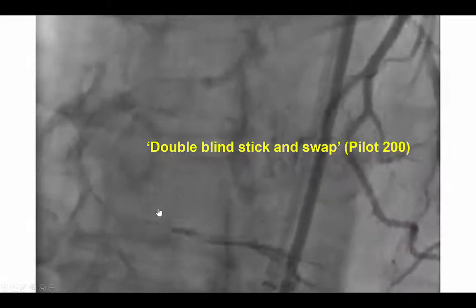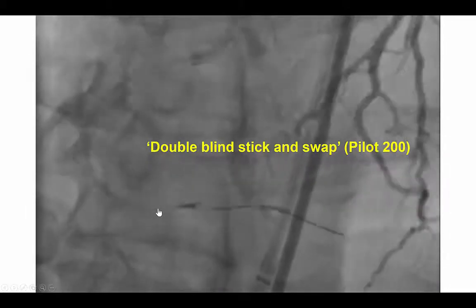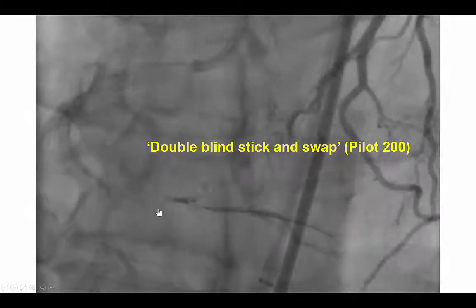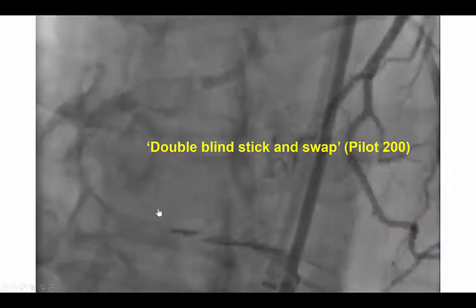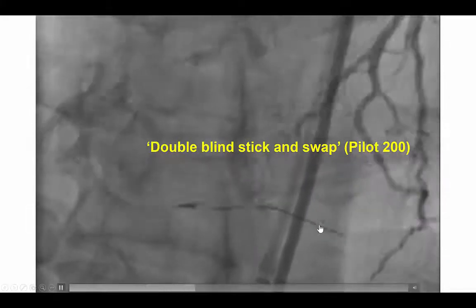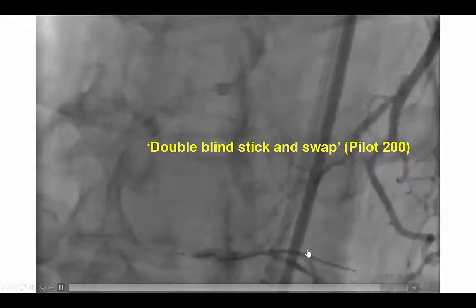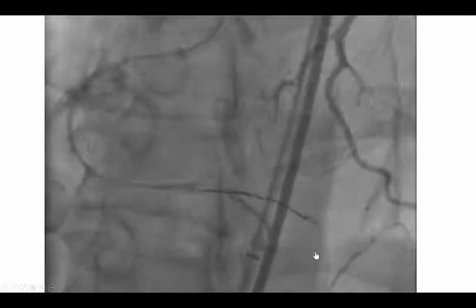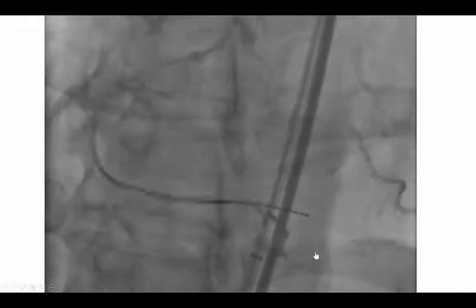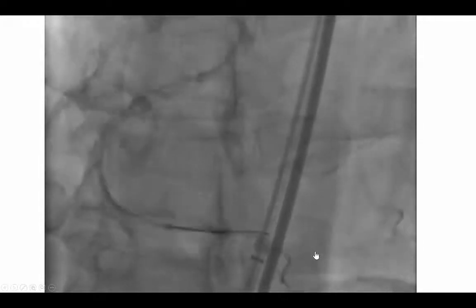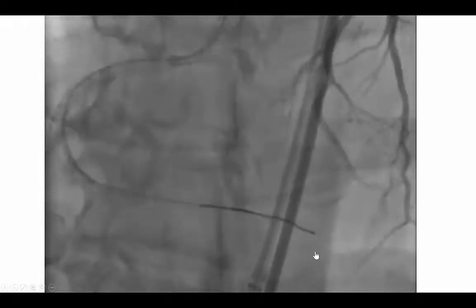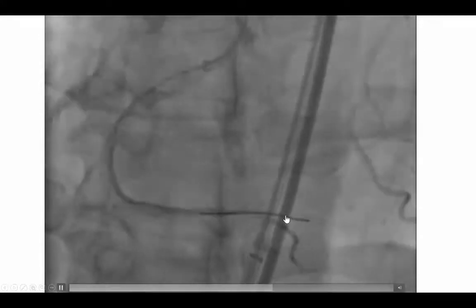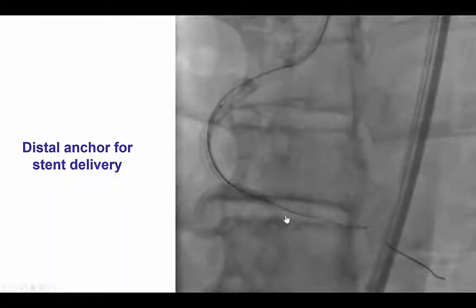We then performed re-entry attempts using the double-blind stick-and-swap technique, sticking with a stingray wire and then switching to a Pilot 200, which appeared to cross into the distal true lumen into a branch of the posterolateral vessel. There was some question whether that was the true lumen, so we pulled back the microcatheter and rewired into a small superior branch, confirming that we were indeed in the distal true lumen.